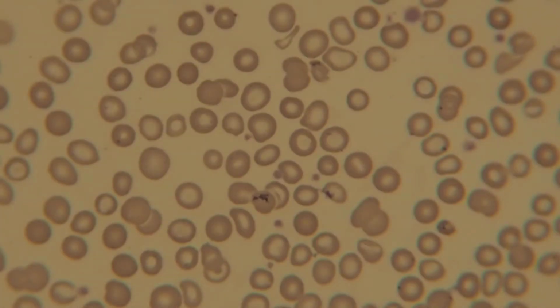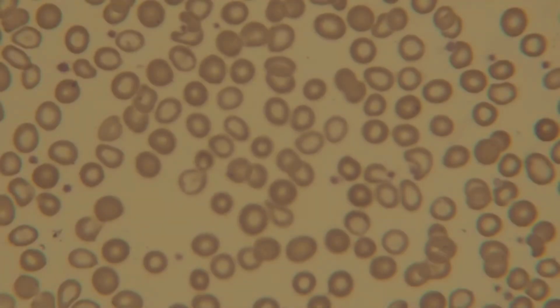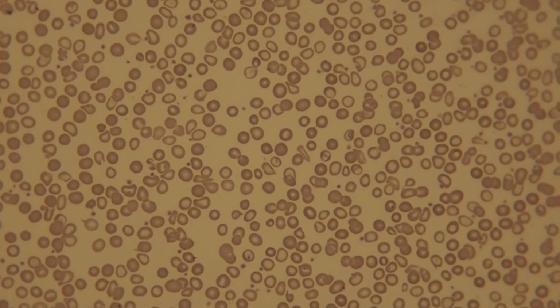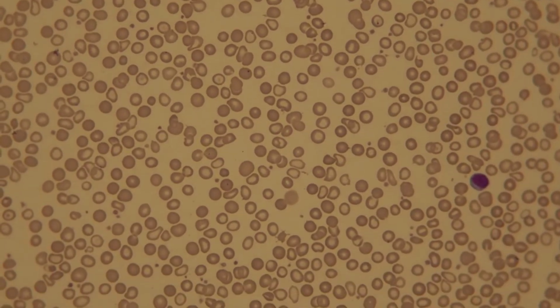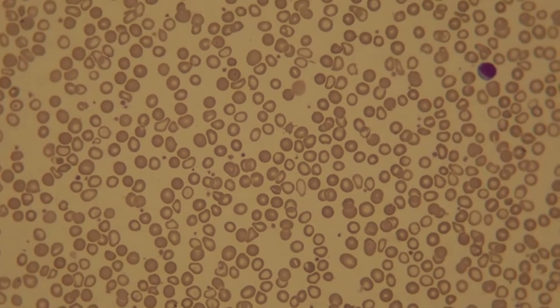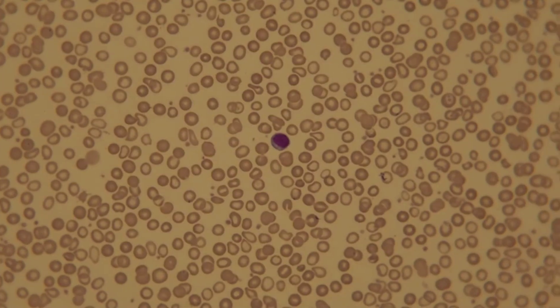Some of the cells have weird formation to them. Sometimes I like doing this, just to see if that holds. Now I find a more mature lymphocyte, and I use that.